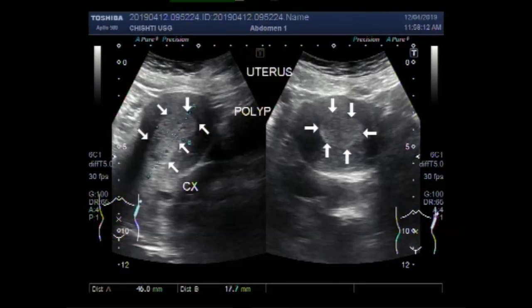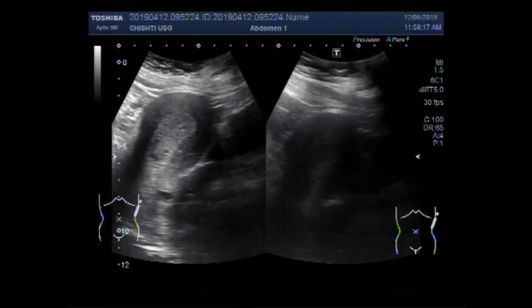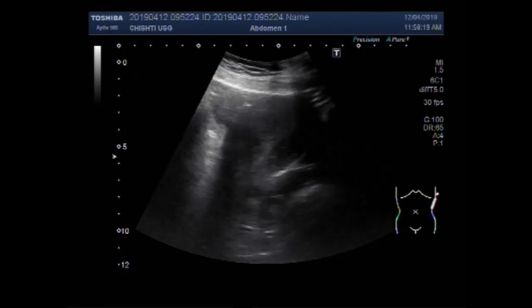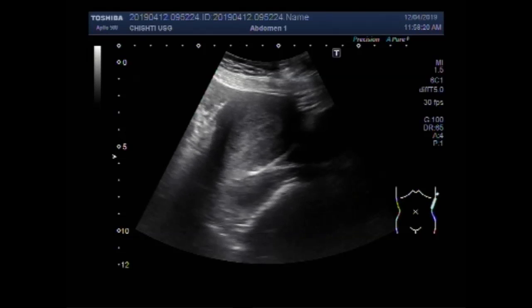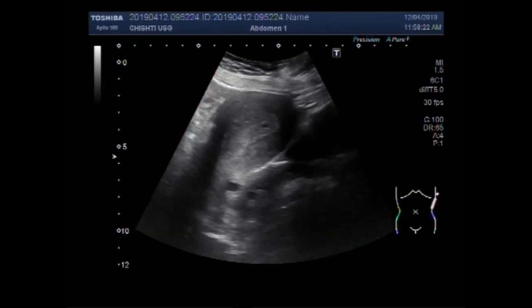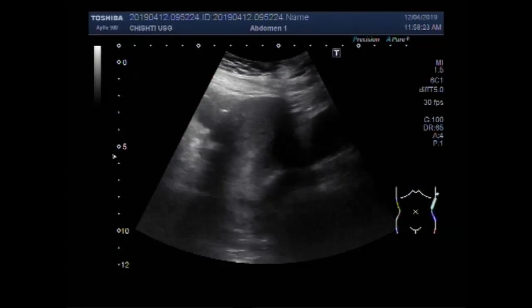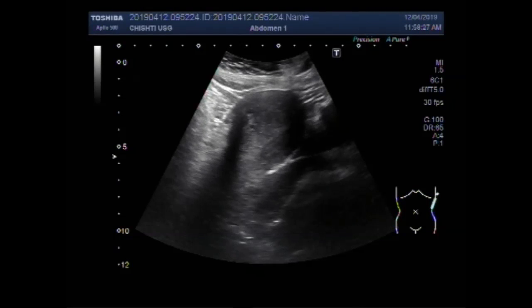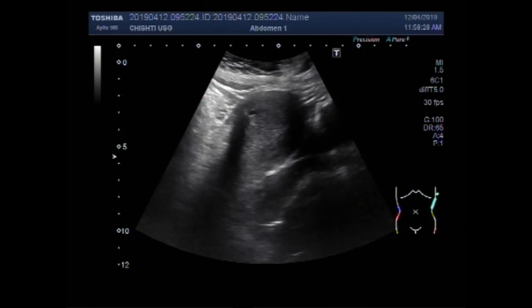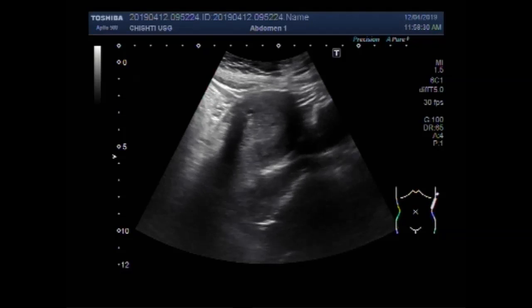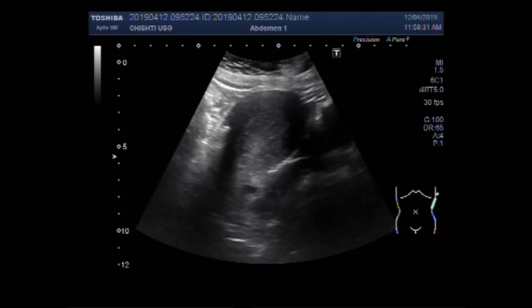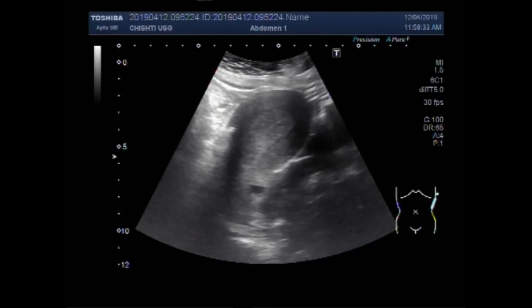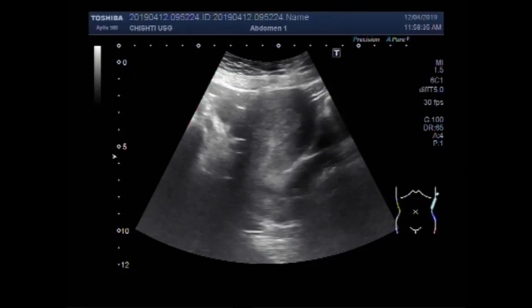Now you can see the second video showing the uterine polyp. Again, the polyp is visible in the distal portion of the uterine cavity.